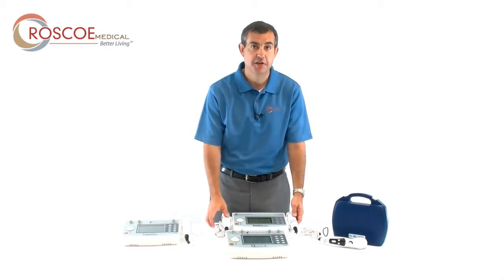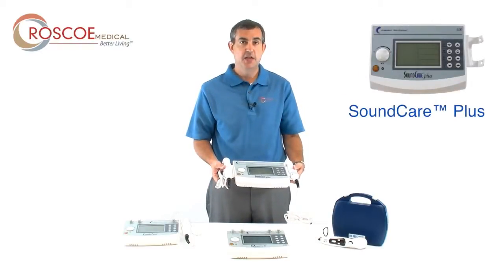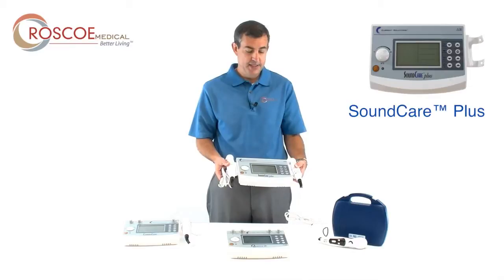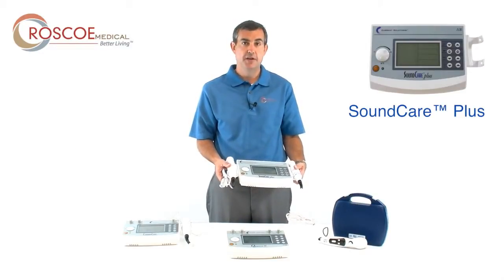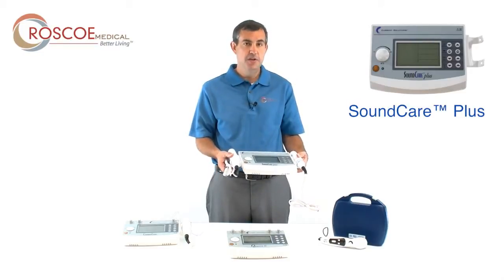The next product in our clinical lineup is called the SoundCare Plus. The SoundCare Plus is a unique clinical ultrasound unit. There are a lot of other clinical ultrasound units on the market, but what really makes us unique is it comes standard with both a one and a five-centimeter sound head. It has all the specifications of any other ultrasound device: one megahertz, three megahertz, 10% duty cycle, 100% duty cycle, 20 presets, and user-defined protocols.